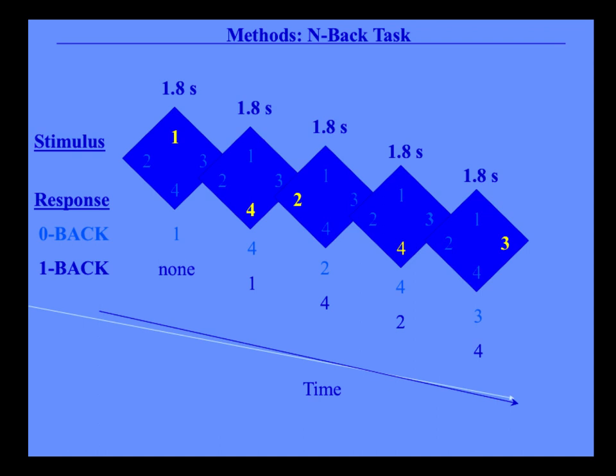Can't be a talk without the infamous N-back. This is one of the major cognitive tasks that we've used, particularly in my group. This isn't specific to MEG. It's more specific to a lot of people who do schizophrenia research and a number of different neuropsychiatric research, where we're interested in memory processes in the brain, which again are no longer focal spots. There's a distributed process, but we need to have some idea of what's going on in working memory. We control for it by using what's called the N-back task. The N-back task is where we present 4 numbers on a screen.